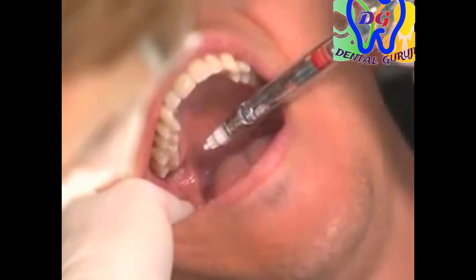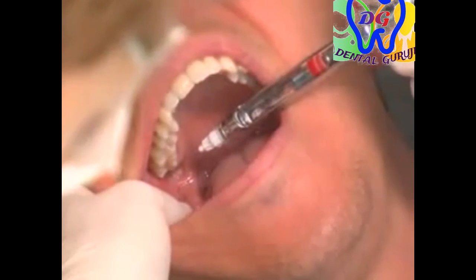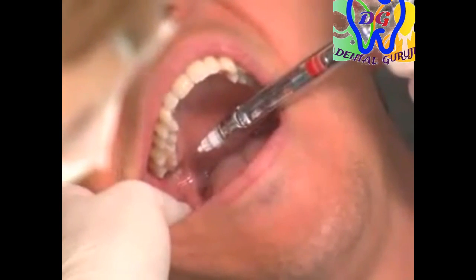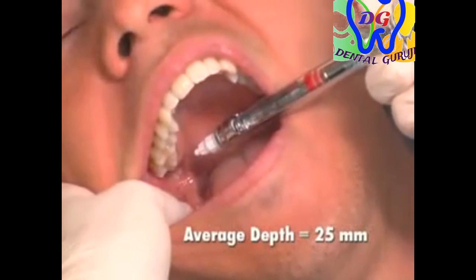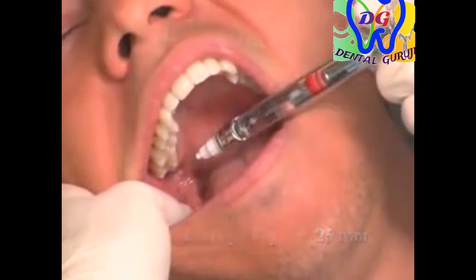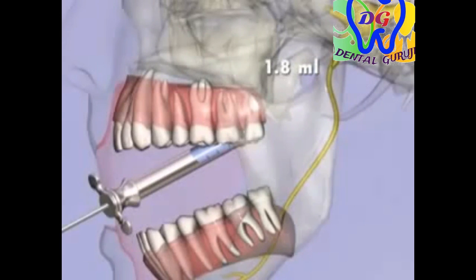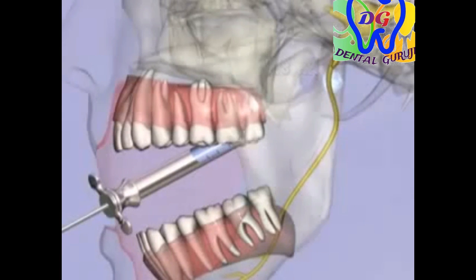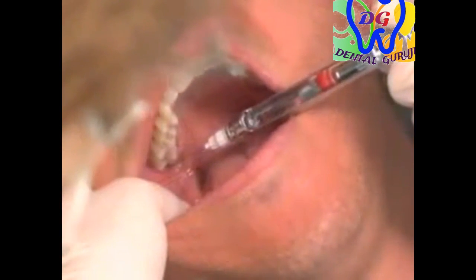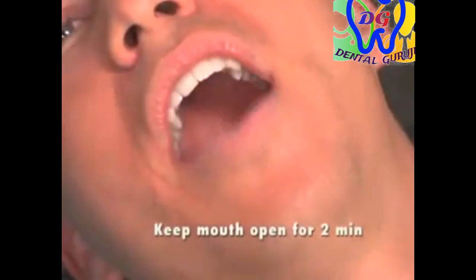The needle is inserted until bone is contacted. The average depth of penetration in the Gow-Gates injection is approximately 25 millimeters. After negative aspiration, 1.8 mLs of anesthetic is administered. Following withdrawal of the syringe, the patient is asked to keep their mouth open for two minutes.